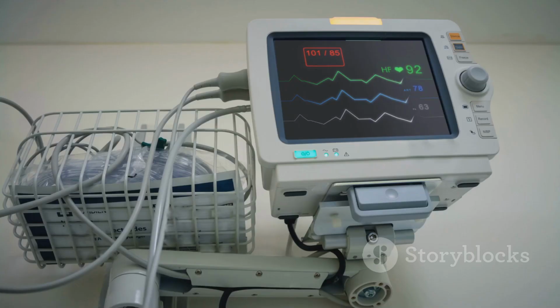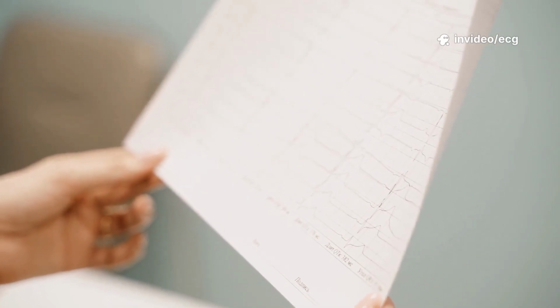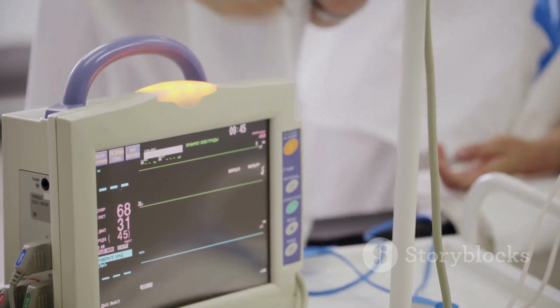Precordial lead V5, fifth intercostal space, anterior axillary line. Precordial lead V6, fifth intercostal space, mid-axillary line. If an ECG looks bizarre, recheck lead placement. Once leads are on, confirm the machine's calibration.